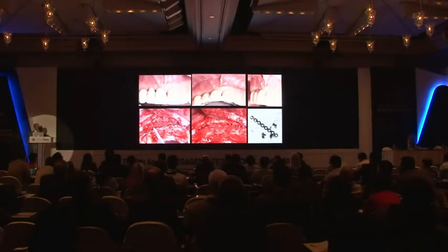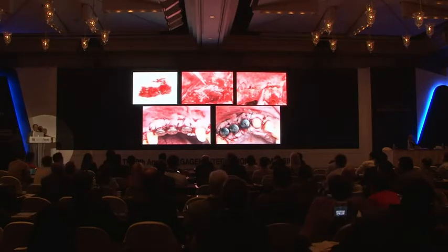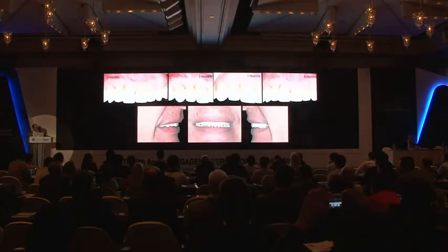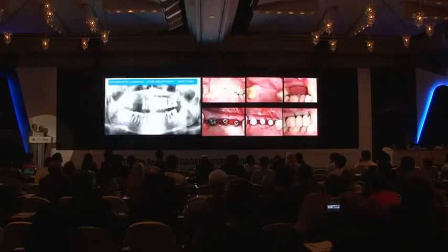After 6 months, we opened again for removing the plate and the pins, and you can see that we obtained a good bone regeneration. We inserted the healing abutment, and we took a connective graft from the palate, inserting it in the buccal depression. The provisional restoration. The final rehabilitation 6 months later. Comparing it with the initial situation, we obtained an increase of the soft tissue.